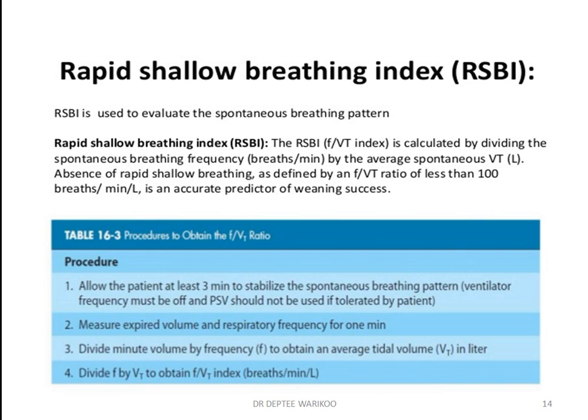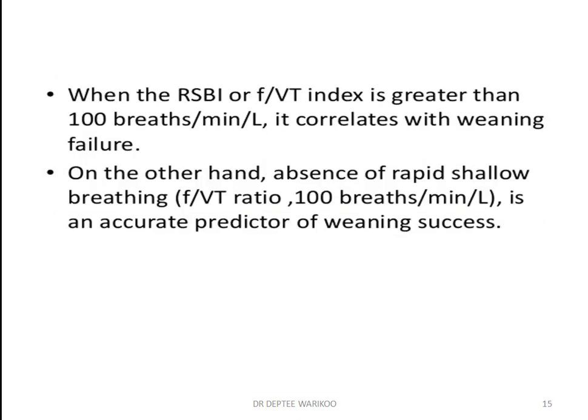So we have to make sure that this is also followed properly. When the RSBI is greater than 100, it correlates with weaning failure. That means we have to stop weaning.